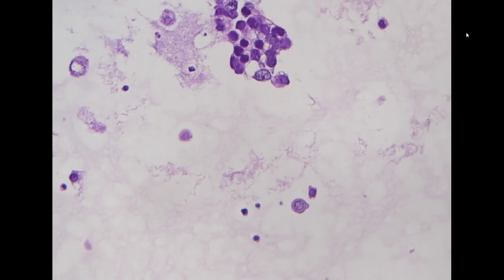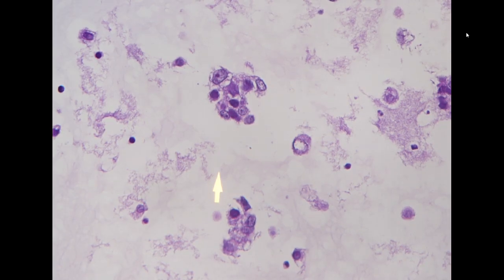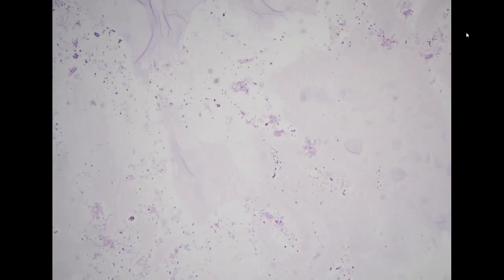And if we see now the cell block for the prior specimen, I think this is positive. Yeah, I think this is likely positive, but it's just very difficult to see on the original preparation.